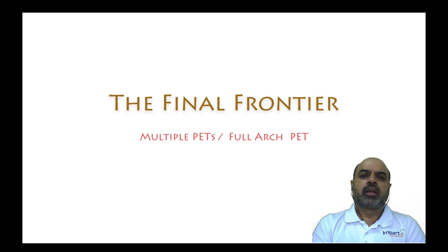Coming to the final frontier, something that most clinicians would love to have in their practices is intact soft tissue around multiple implants done in the aesthetic zone, or sometimes even full arch cases. Something that we've always wanted to do is to have the classical FP1 prosthesis whenever we are doing full arch cases or multiple implants in the anterior maxilla.